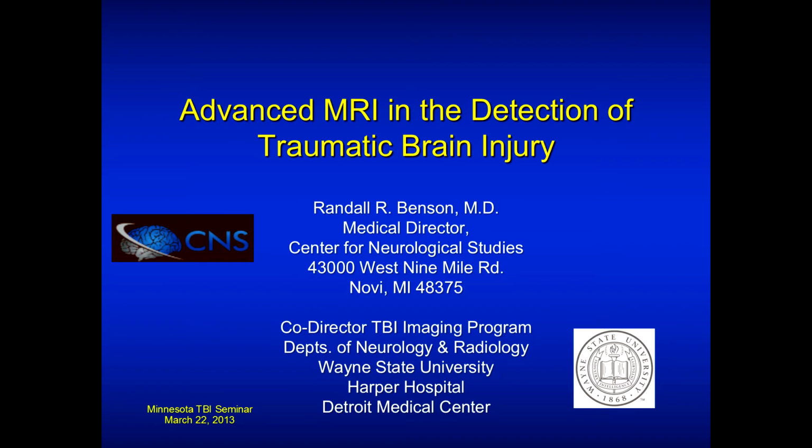Okay, I guess we're on. Okay, thank you, Dr. Haacke. Now we're going to transition to talking about diffusion tensor imaging and using the images in concert with each other.